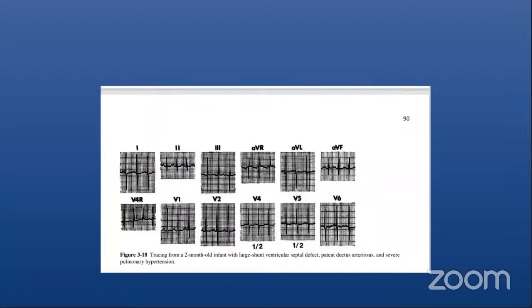This is just to give you an example of the ECG of a smaller child who has left ventricular hypertrophy. Looking at that ECG, you really have to look carefully. This ECG is half standardized. So when you look at the R wave, it's not 15, basically it's about 30. That's why it's important to look at the scale of the ECG.